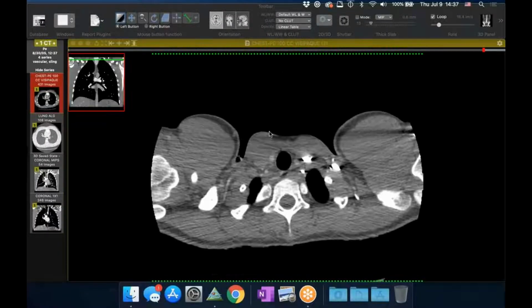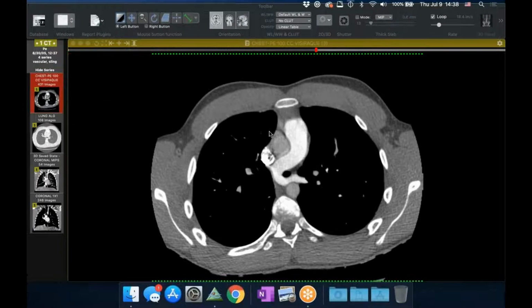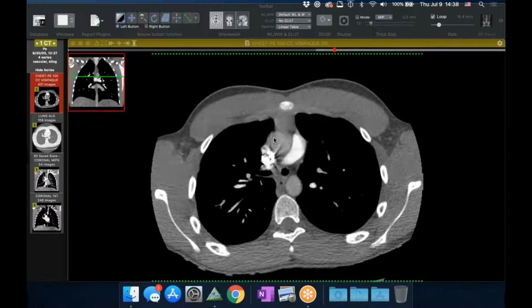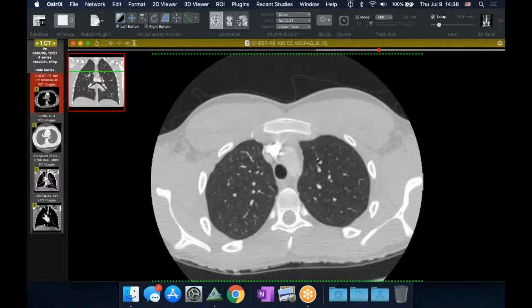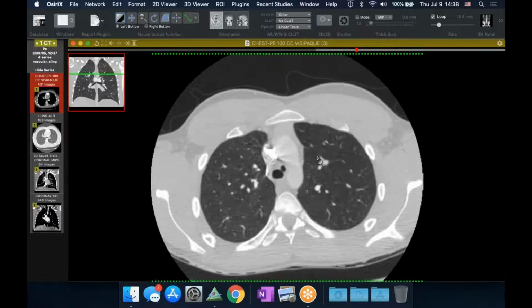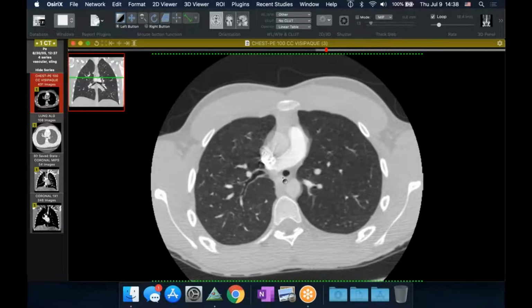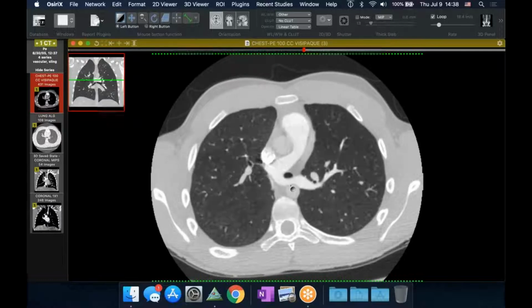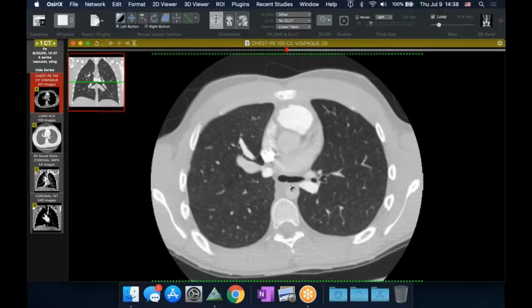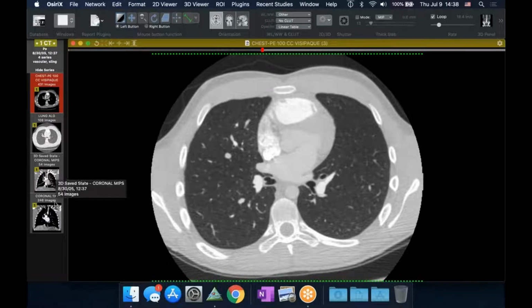So this is David's case. And there's the sling there, but you can see the lung windows. You've got this funny looking airway. So there's the trachea, and then you see this bifurcation right here at the aortic arch with this small, funny looking carina there. And then this bronchus here continues down the mediastinum. This goes to the right lung. The sling wraps around it, and then it branches again and supplies the lower lobes there.